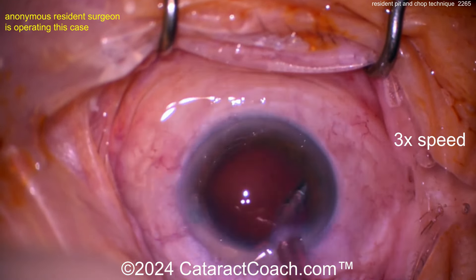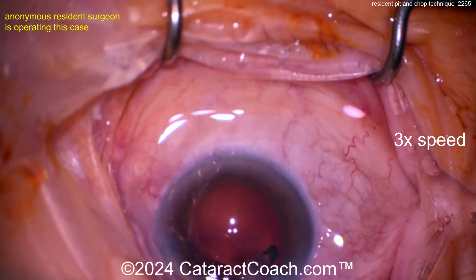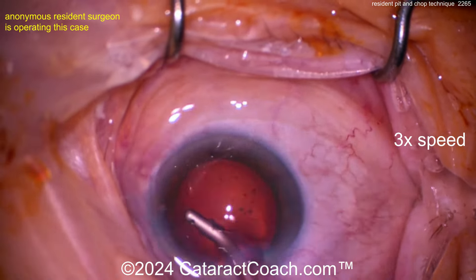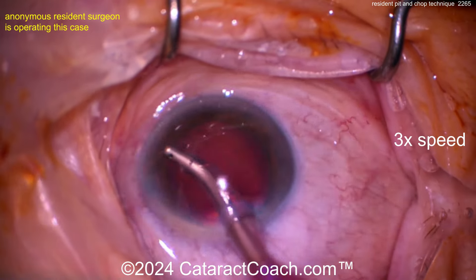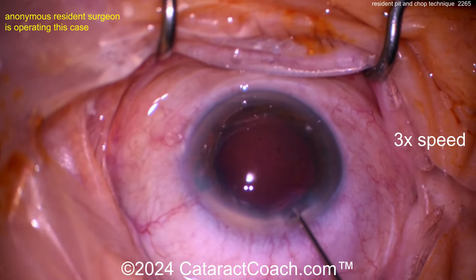Now by coaxial irrigation aspiration, cleaning up that capsular bag. This is a great recipe — you've done a fantastic job at this point. I think you just need to keep learning on your own and advancing your skills, racking up more and more experience. Let me ask you a question — I look behind the posterior capsule.